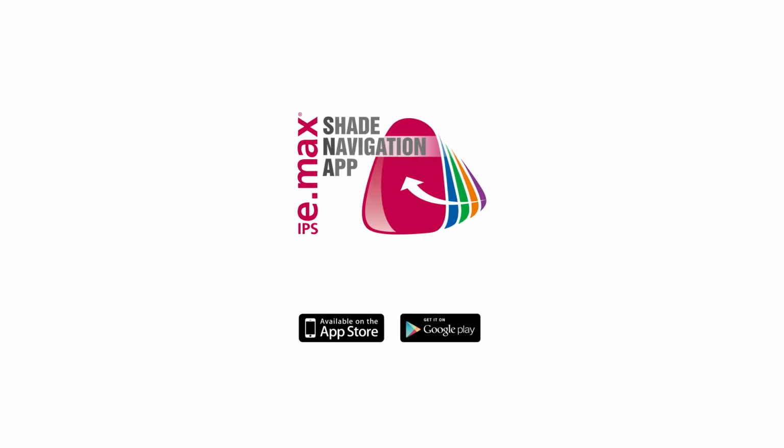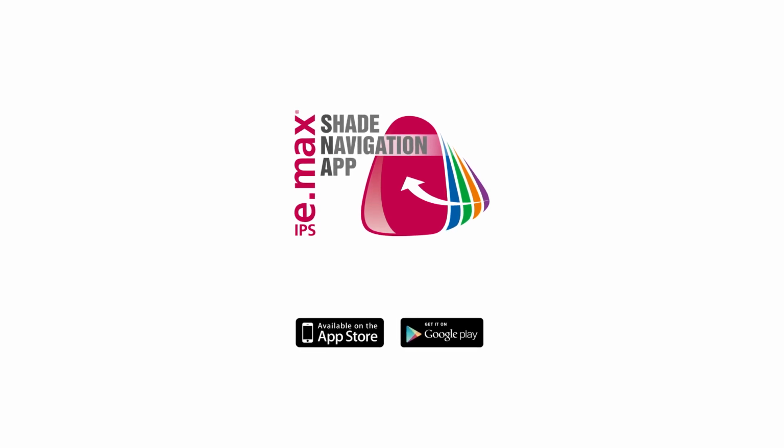IPS e.max Shade Navigation app, so shade and translucency always match.